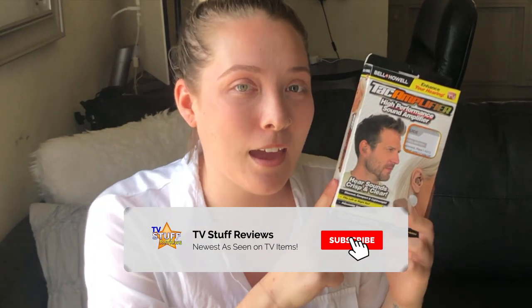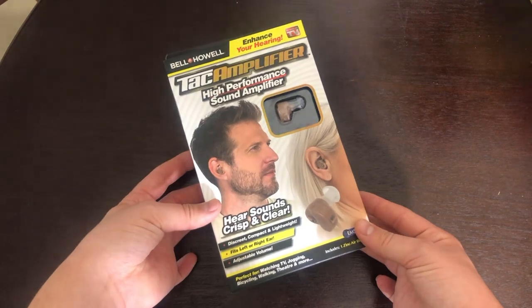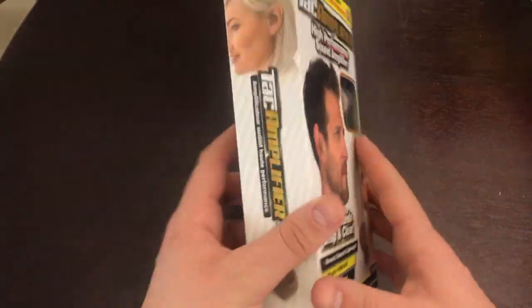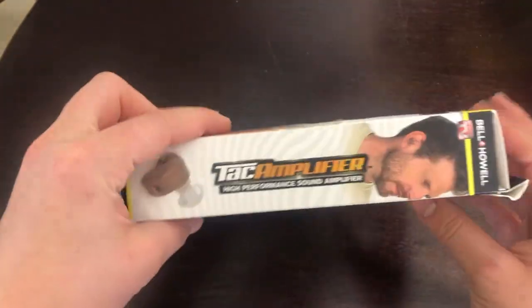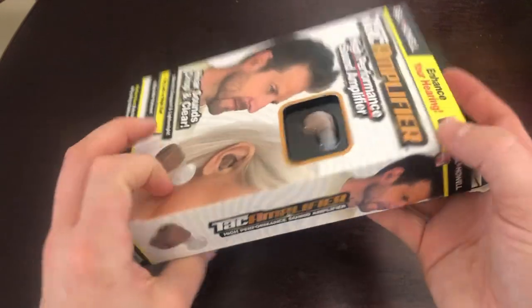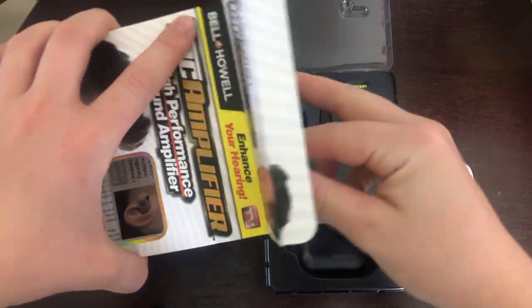Today I'm going to be reviewing the Tac Amplifier, so let's get into the video. Here is the Tac Amplifier product — it says that we should be able to hear crisp and clear sounds. It's compact, and I just wanted to show all the sides of the box so that you know exactly what you're getting.